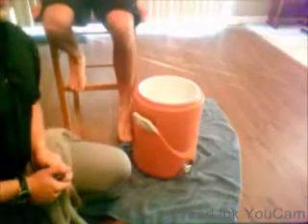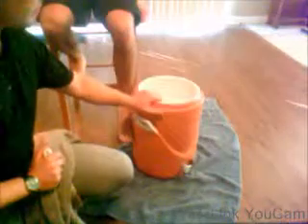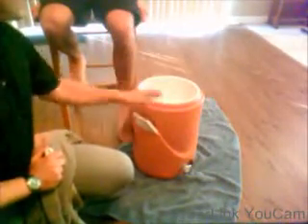Okay, now we would go through the process of the actual treatment application with our patient here, myself. First, you're going to have to get a tub. You want to clean and sanitize the tub before bringing it out. Next, you're going to want to take the patient, seated, and make sure the opposite limb is supported.